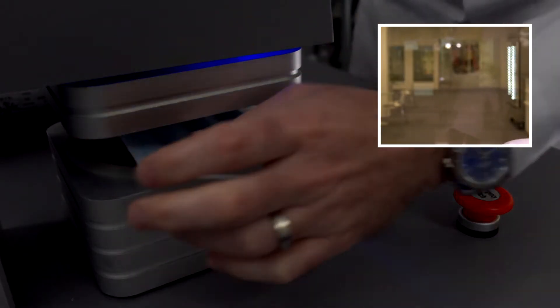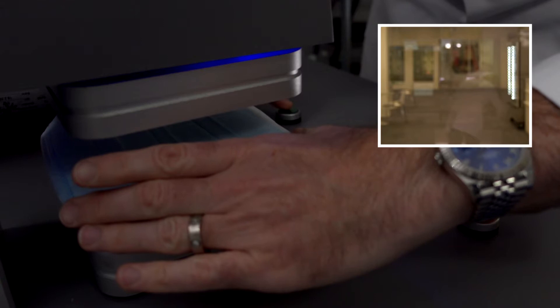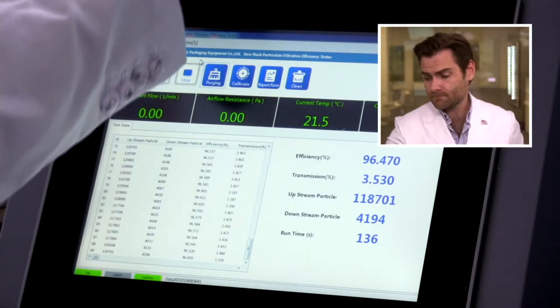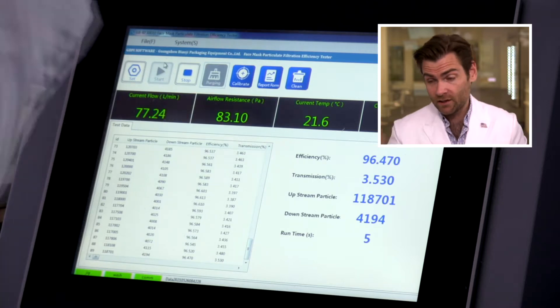We have the clamp cam — aka the watch ad, unintentional watch ad. And there we go. Let it rip. This is a PFE machine, a particulate filtration efficiency machine. If you want to find out more about how this works, check out the link.